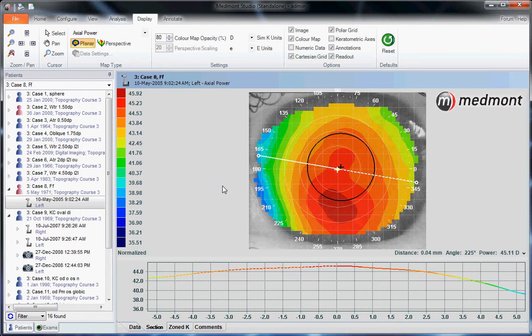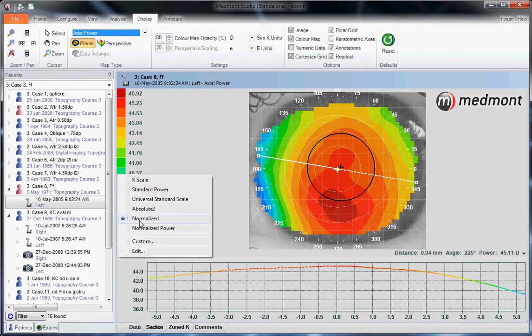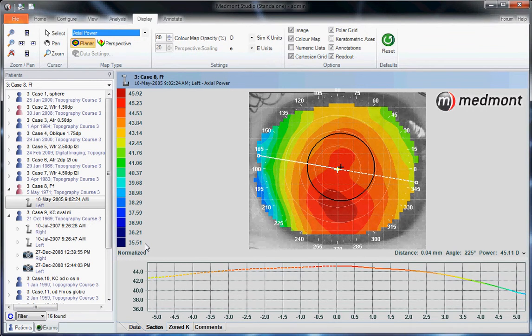One of the ways to determine whether this is an abnormal eye, beyond just looking at the power across the eye or the shape of the topography, is to go to the scale range on the left-hand side with an axial map selected under display, axial power, and go to a normalized scale. That shows us the full distribution of power across this topography. The bottom of the scale indicates the flattest point is 35 diopters and the steepest is 45 diopters — a difference of 10 diopters. Normal corneas fall within a 10-diopter distribution of power, so this patient is right on the threshold between normal and abnormal.